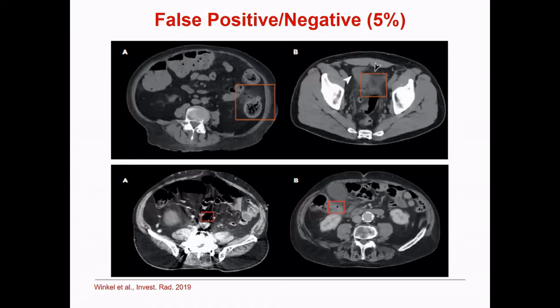But like I said, I can talk half an hour about what you could do to have constant image quality, which to me is the first step you should have if you look at the whole process of generating an image, extracting information out of it, and then basing diagnostic thoughts on that image. So that's images, and how you can start to find findings and get something structured out of images, although they are in themselves unstructured.